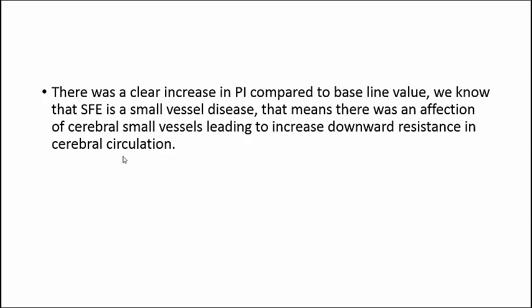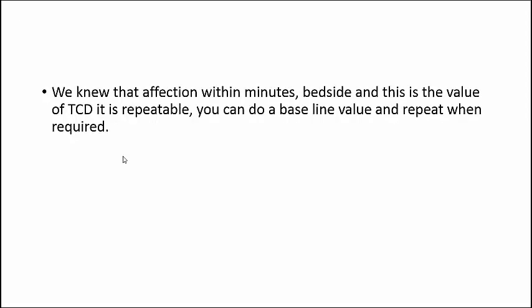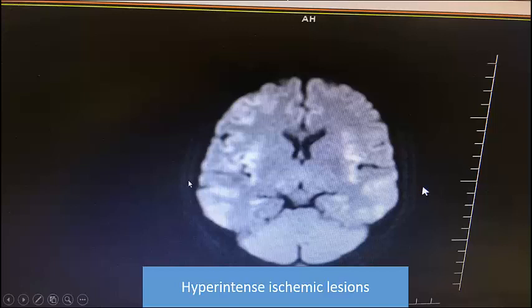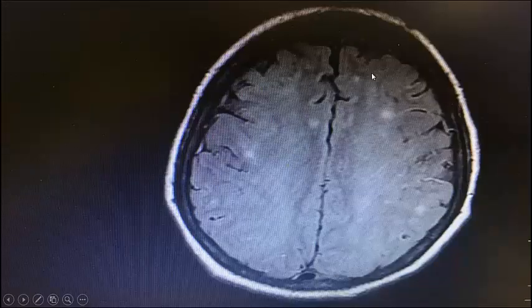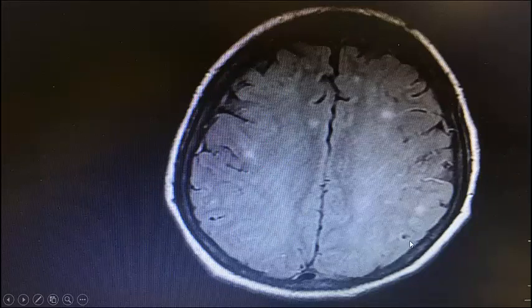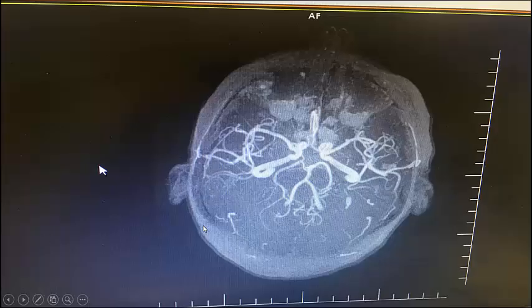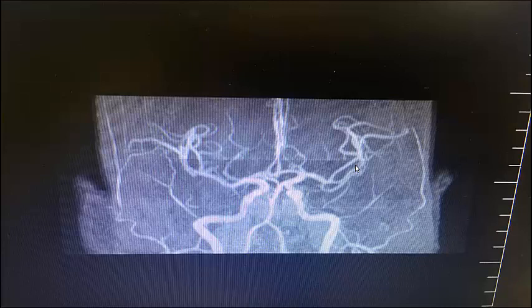This valuable information was obtained non-invasively in just a couple of minutes, allowing us to build our management accordingly. MRI confirmed hyperintense areas on diffusion imaging — multiple ischemic lesions and small bleeds — consistent with small vessel disease. CT angiography showed normal macrovessels, confirming this was truly small vessel pathology from fat embolization. TCD-driven pulsatility index has sensitivity of 70-89% and specificity of approximately 86% with a high negative predictive value for diagnosing small vessel disease.